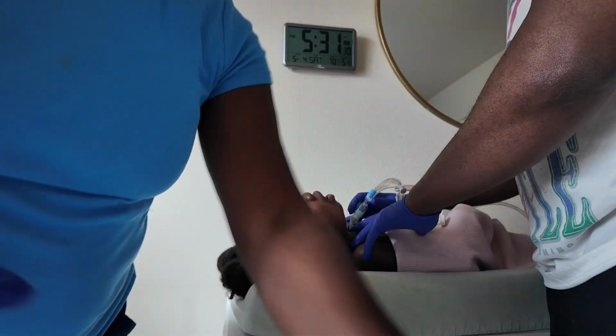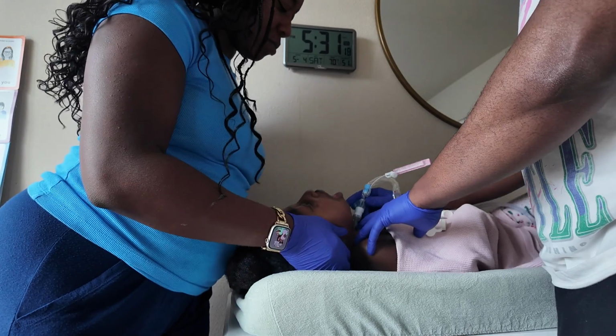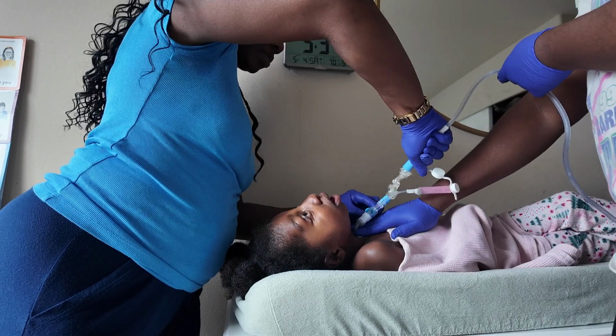So it's really crucial that you communicate with your partner. So I'm telling him, I'll say crib side, I'll say wall side. I'll let him know she needs a suction. So he just turned the suction machine on and now I'm giving her a suction.